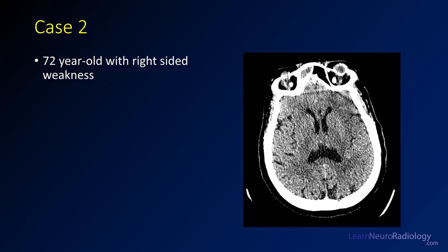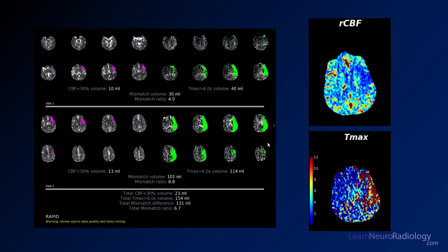I'm a little concerned, particularly given the right-sided weakness, that we have a little bit of an area of hypodensity on the left side here, but it's kind of ill-defined. I'm not super certain about it. So we're going to go on and get CT perfusion, and here are our perfusion results.